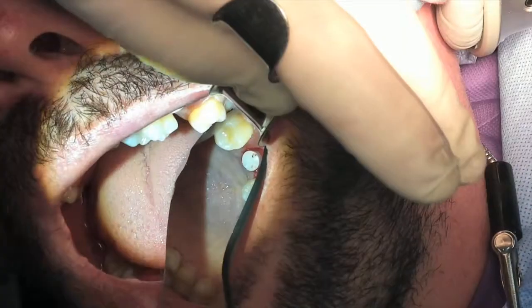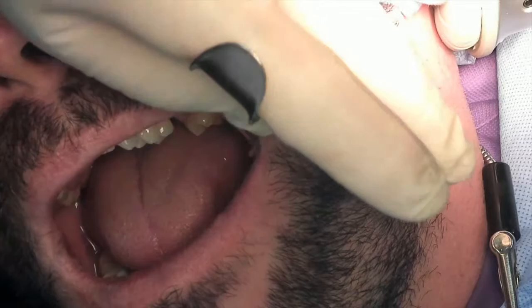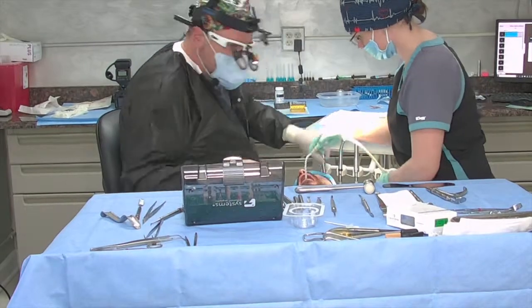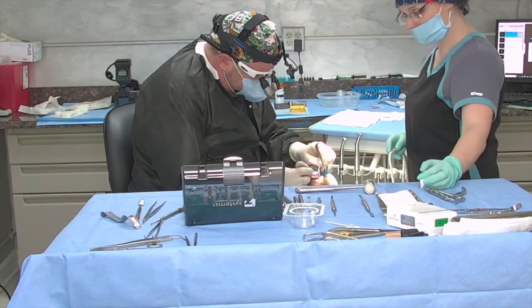No stitches, no nothing. That'll form a clot within 10 minutes. And there's no reason to really go back anymore. Let me give Matt a little rinse. And we can take one more look at this stuff. And I'll finish. There we go.